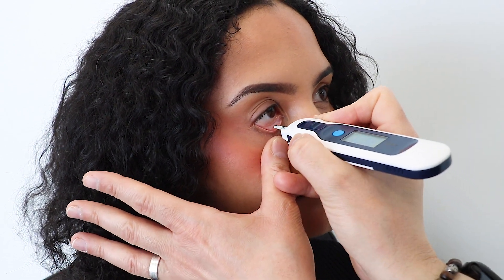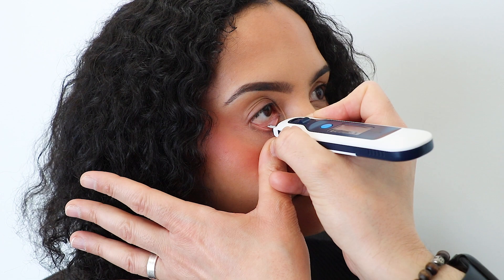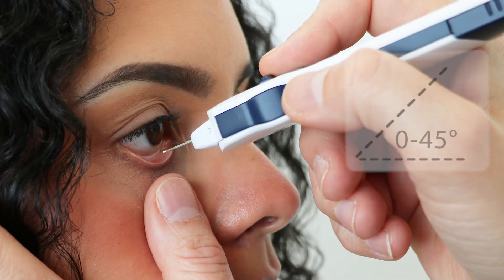Turn on the eye pen. With the patient's lower eyelid held, position the tip of the single-use sensor just above the inverted lower eyelid with the LCD screen facing upwards. Approach at a 0 to 45 degree horizontal angle and gently lower the end of the single-use sensor onto the conjunctiva on the inside of the lower eyelid.